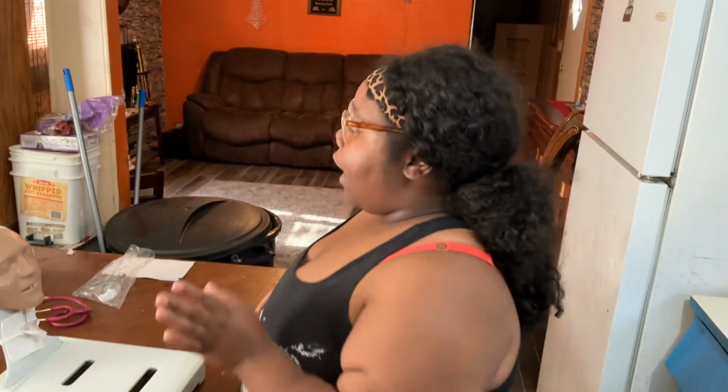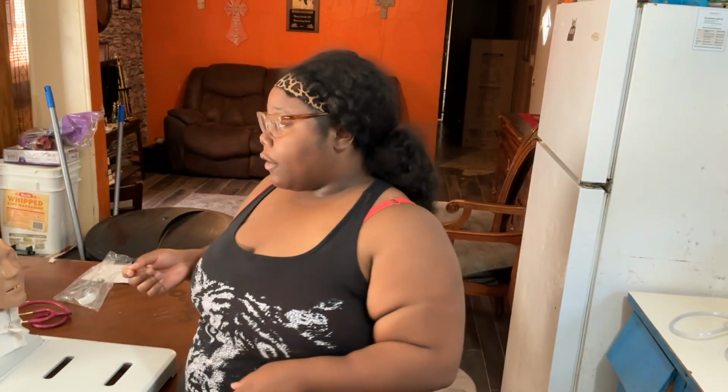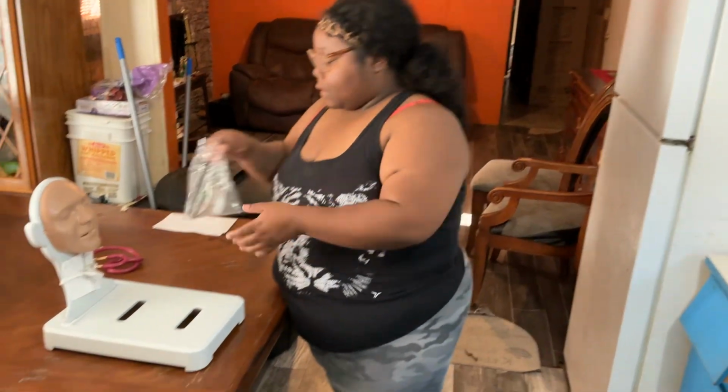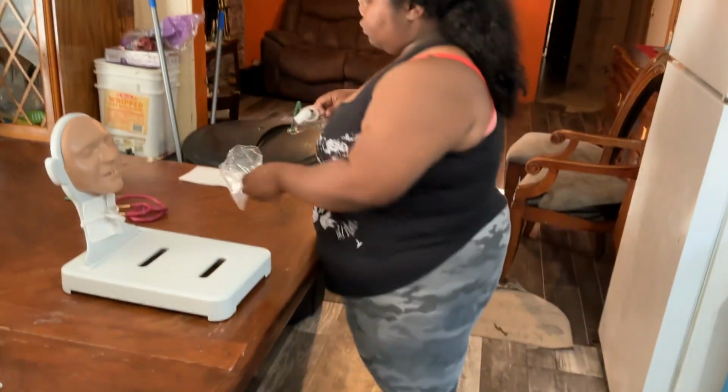Before I suction my patient, I don't have those supplies in here to do this, but I will verbalize. I am in a home setting, but I would oxygenate my patient. I would hyperoxygenate my patient. So I'm going to turn my oxygen dial up for my patient, all the way up, and I'm going to hyperoxygenate. Also, I would turn my suction dial on at this moment. It's going to be less than 125 millimeters of mercury, so I would turn that on. Alright, let's go ahead and get your oxygen.